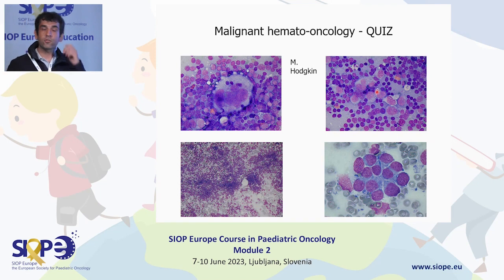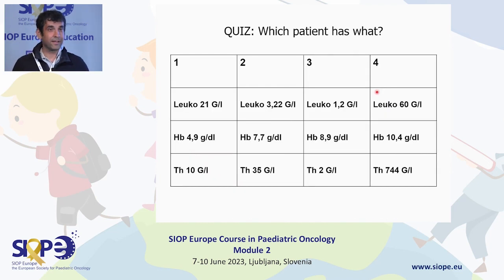What's this? This patient was 2 years old, with a big tumor within the abdomen. We performed the bone marrow puncture. Yeah, they can be leukemic. So we don't need any biopsy, because if they are leukemic, we perform all the biological tests on the neuroblastoma cells. Okay, then we come now to the end.